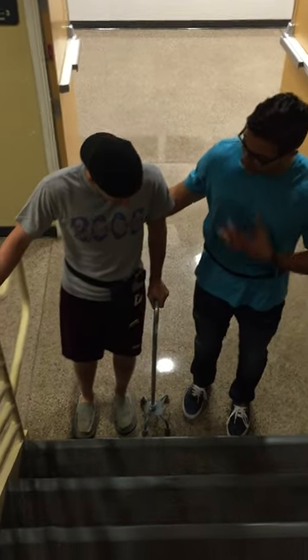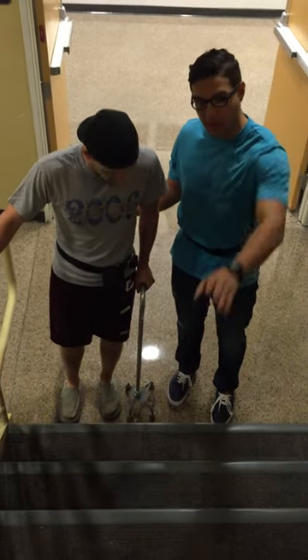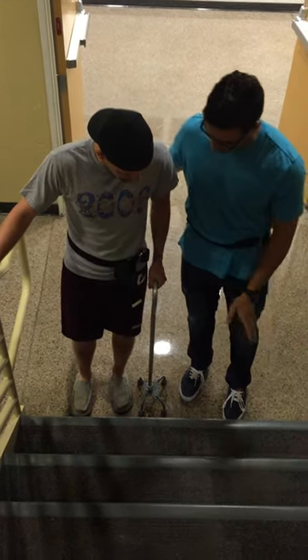Alright Kyle, how are we doing today? My name is Johnny, I'm your student physical therapist today. What we're going to do is we're going to ambulate up these stairs, make a turn, and then come back down. Now I know you have some hip arthritis, so kind of be careful of that.